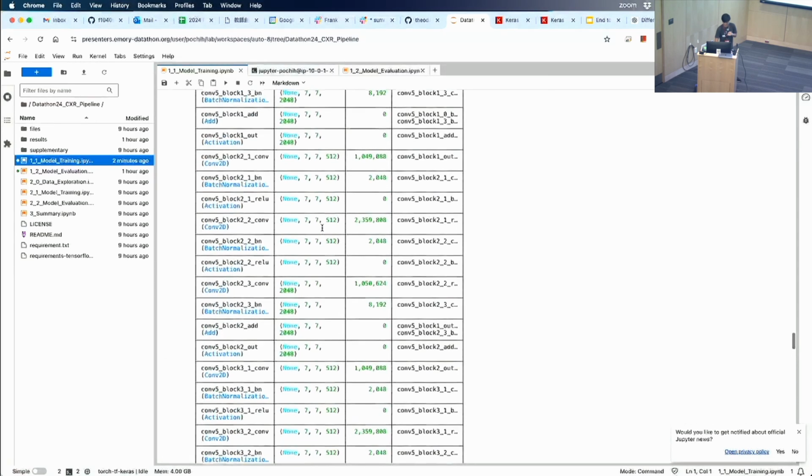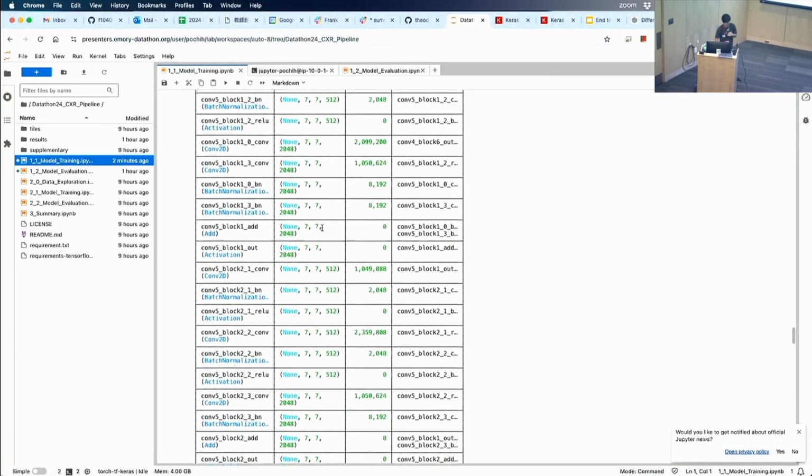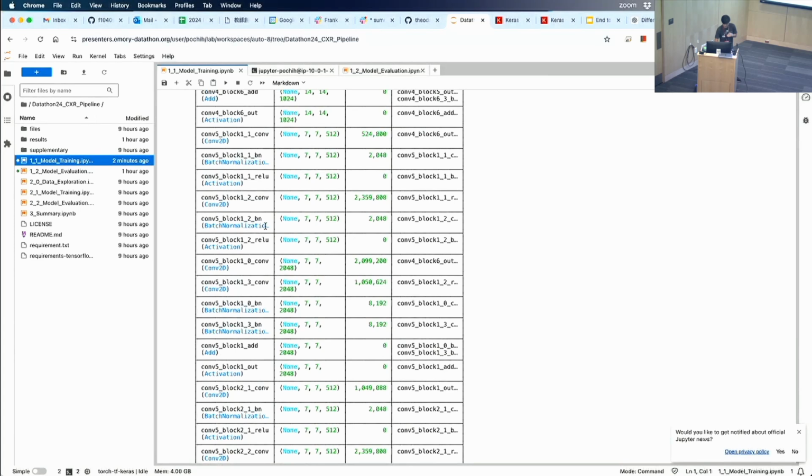It's not a very frequently asked question. The answer is inside the batch normalization. You can see there are some layers with BN, meaning batch normalization. Normalization is something mentioned yesterday; you can normalize certain variables. Here we try to normalize the images within the batch.